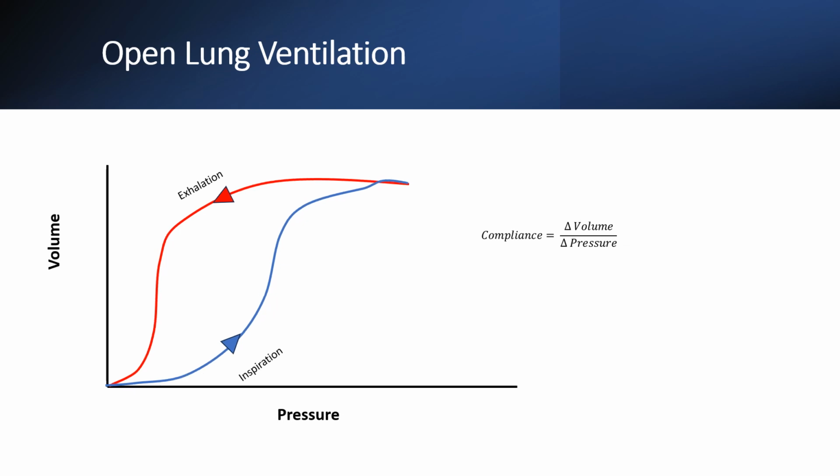When the pressure is applied to inflate the alveoli, it can create shear stress. The upper inflection point is when the slope of the inspiratory limb decreases, and can be considered the point of overdistension. This point indicates that the maximum number of alveoli are inflated and nearly at the maximum volume. As the slope indicates, any pressure applied beyond this point will result in minimal volume return. Ventilating at pressure beyond this point may result in barotrauma, one of the most frequent complications occurring in mechanically ventilated infants, and lead to bronchopulmonary dysplasia.